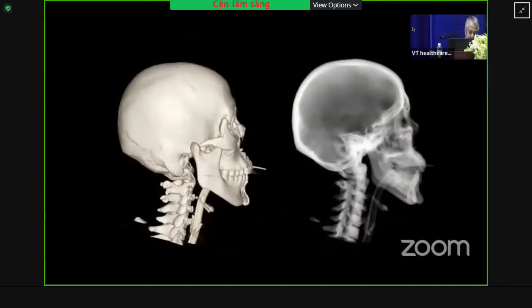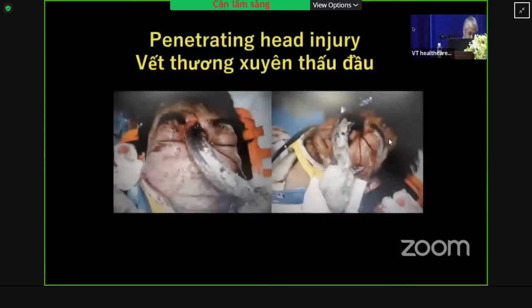The same applies to the side image, even in the direction of the right temporomandibular joint, on X-ray image. Penetrating trauma caused by metal pieces is a situation where damage is not clear due to metal artifact in CT. But in 3D, the position of the metal piece can be confirmed by creating metal pieces and bone.